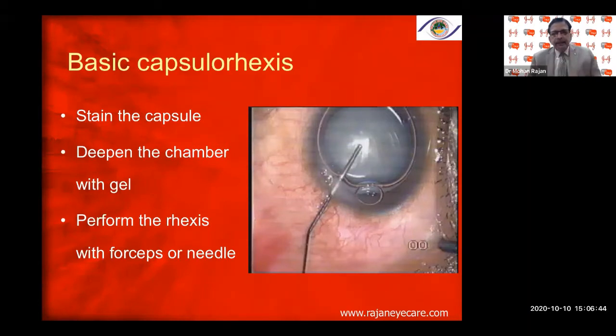Always put the trypan blue under a bubble of air, because the air creates a beautiful surface tension on the capsule surface, and the trypan blue spreads uniformly over the anterior capsule. Then perform the rhexis with forceps or needle — you can use a 26-gauge needle, a micro-rhexis forceps, Utrata forceps, or a side-port micro-rhexis forceps.